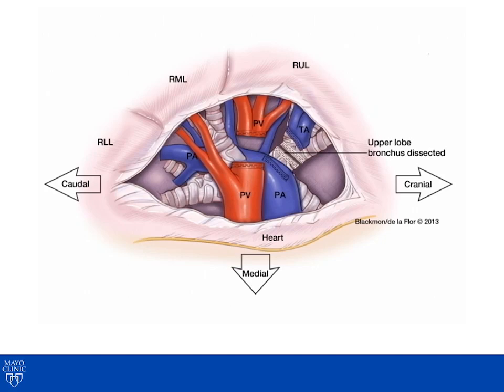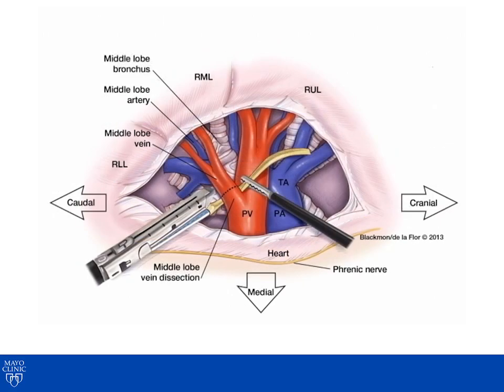port. For a thoracoscopic right middle lobectomy, the approach is slightly different than that for a right upper lobe or right lower lobe. The structures are similar from the back, and you should perform the posterior dissection of the pleura first. Once that has been performed, you can then begin to approach from the anterior aspect of the hilum.